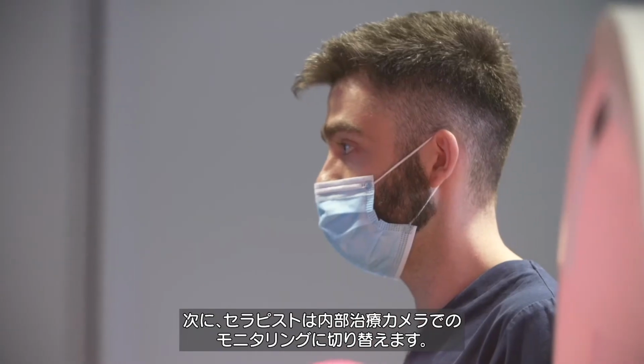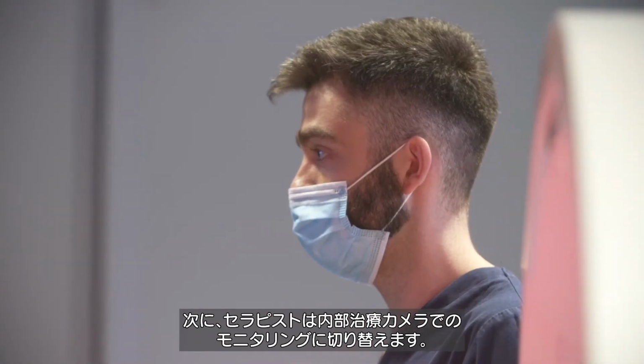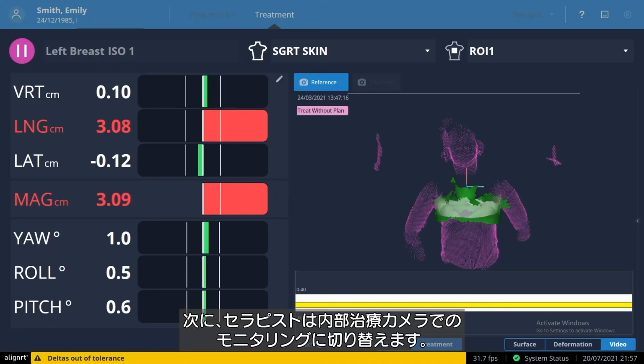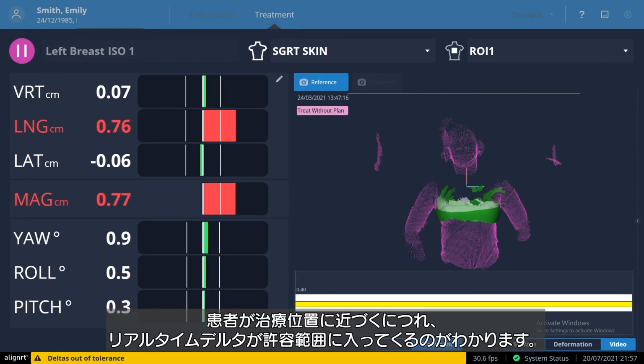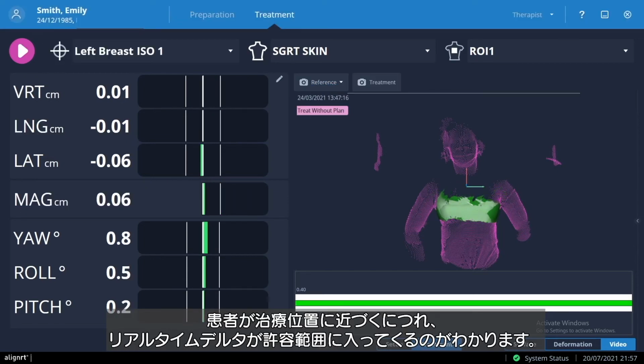On AlignRT, the therapist then switches to monitoring with the internal treatment cameras. As the treatment couch and the patient move into the bore, you can see the real-time deltas coming into tolerance as the patient reaches their treatment position.